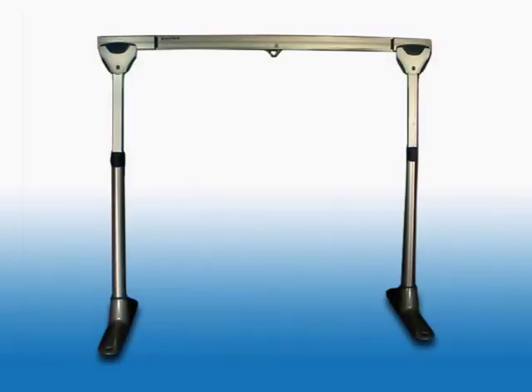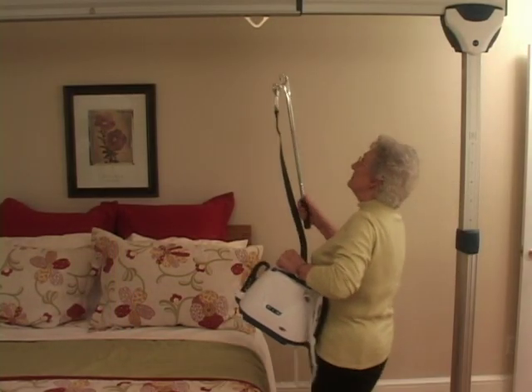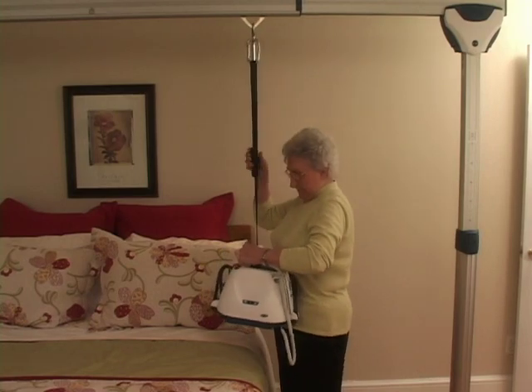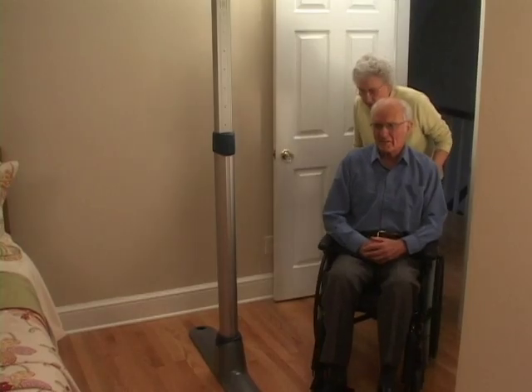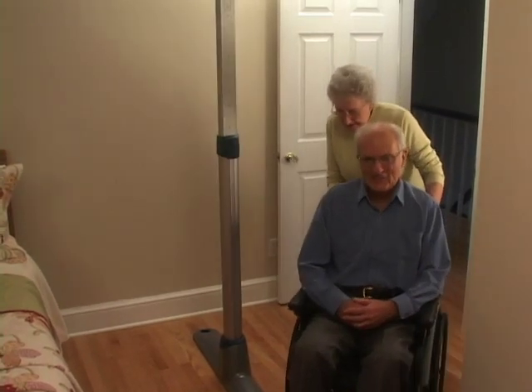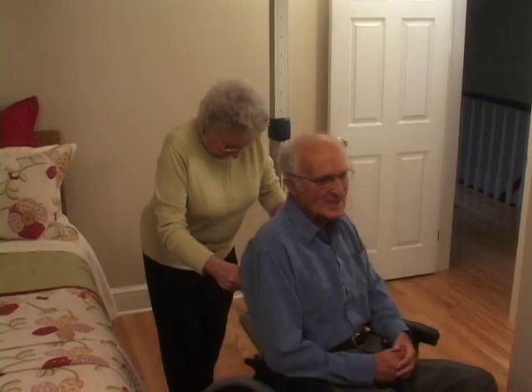The EasyTrack FS has a safe working load of 440 pounds or 200 kilograms — exceptional for a portable product, making it suitable for use in most any home. Our systems are not only designed to safely lift and transfer your loved one, but to help protect you from back injury due to lifting. Your good health is essential to providing continued care and support for your partner in your own home.